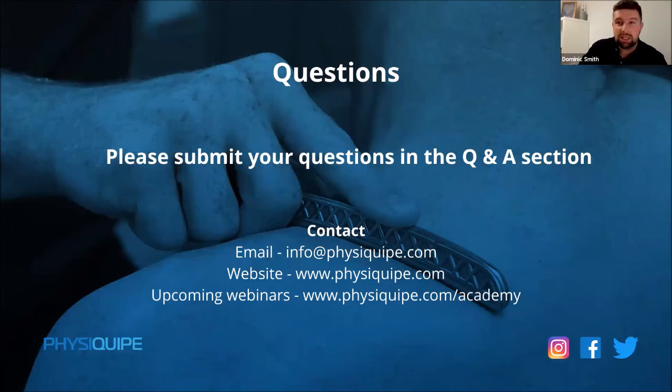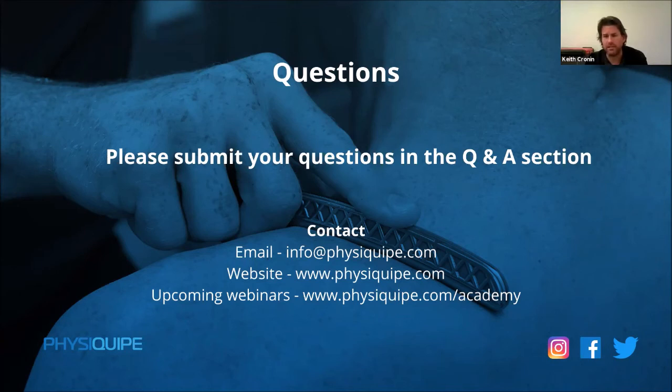So when you send a patient home with one of these, how long and how often can they use it? Sorry, it's the same question twice, I've just misread that. Yeah, so you can use it multiple times a day. I recommend around 10 minutes at a time, because you found that the most therapeutic is somewhere between 3 and 7. So 10 is a nice even number, and it means they're most likely to hit that threshold.